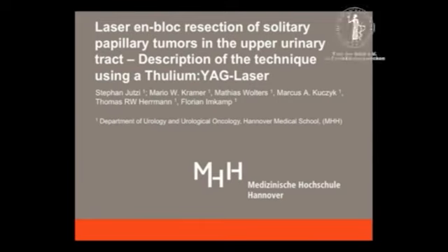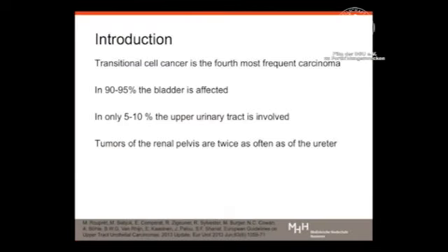Laser en-bloc resection of solitary papillary tumors in the upper urinary tract. Description of the technique using a Thulium YAG-Laser. Transitional cell cancer is the fourth most frequent carcinoma.